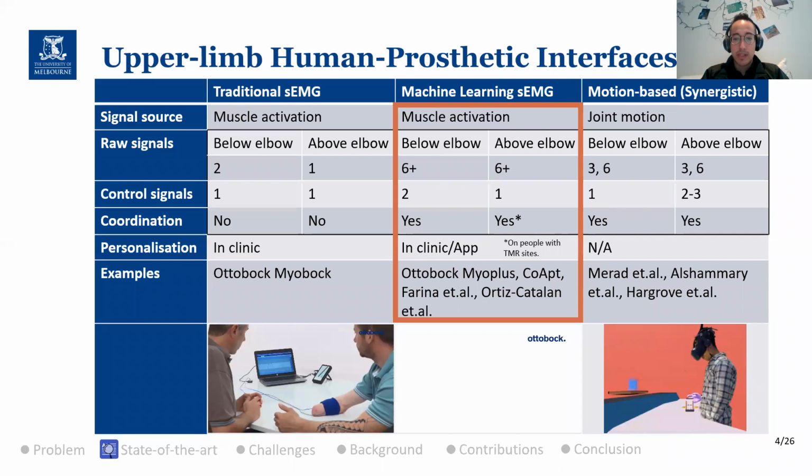So that has worked really well. But the problem is that when you go to higher amputations, you lose all those signals, right? Because they're based on the muscles. On your upper arm, you have the biceps, which drive the elbow only. So again, we have the same problem.